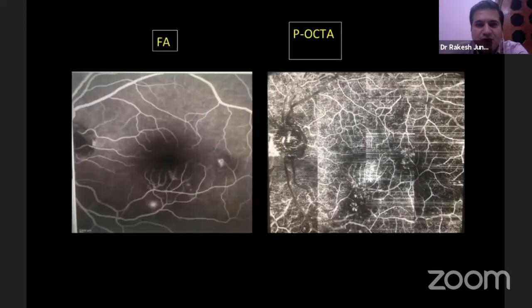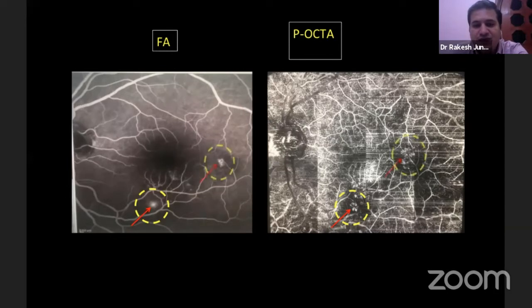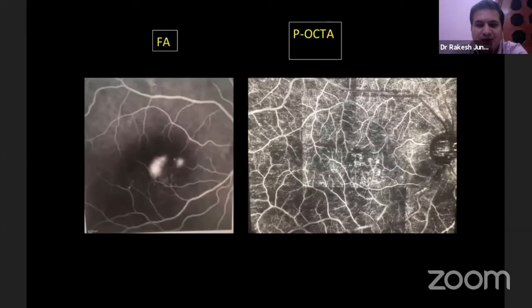This is a comparative picture of fluorescein angiography with panoramic OCT angiography. One can see that the area of leakage — the ink blot leak at the inferior arcade — very well correlates with the dilated bulb-like tuft of choriocapillaries at the choriocapillary network on the panoramic OCT angiogram. Similarly, a previously treated area of leak also shows as a thin regressed choriocapillary network at the point treated with focal laser.